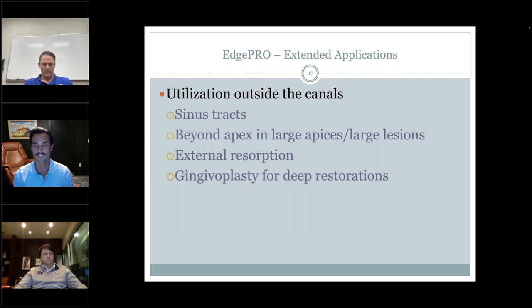External resorption, I've done it in a few cases, but we're seeing more and more of those in our practice. You may be seeing the same. And then, like Charles and Craig both mentioned, the gingivoplasty and modification of the gingiva for deep interproximal restorations.